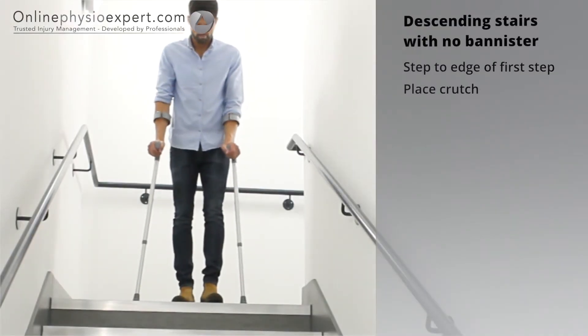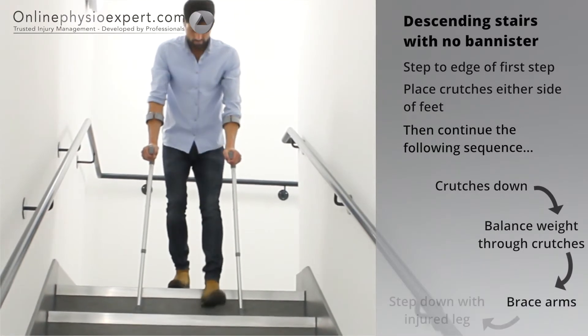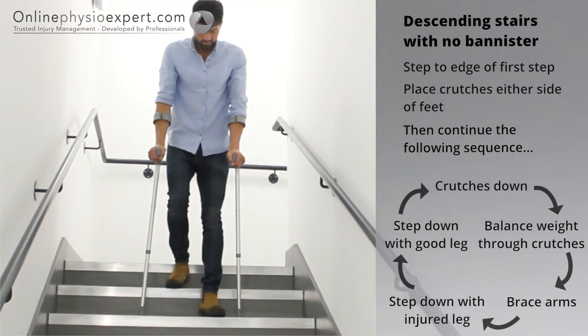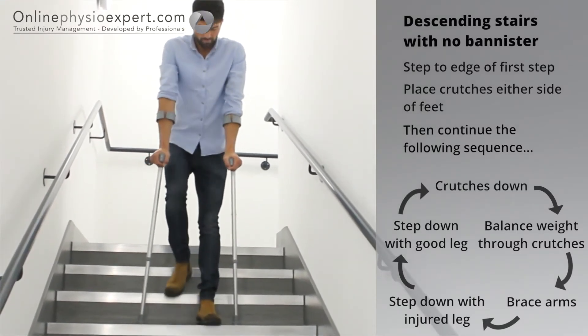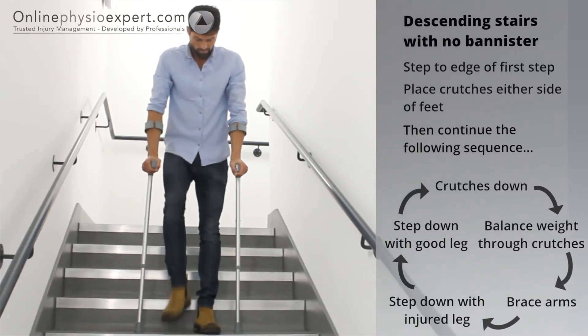To descend stairs with no banister, step your feet to the edge of the first step. Place the crutches down to the next step before stepping your injured leg down, followed by your non-injured leg. Repeat these sequence of movements until you safely reach the landing.